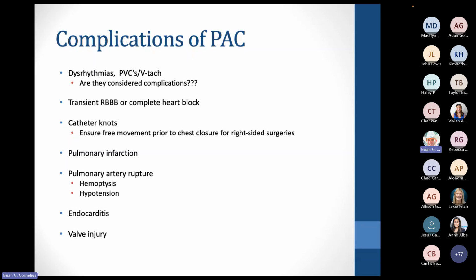So that's one of the reasons so many places are very cautious about how they maintain the syringe on there, what they do with the lock, those sorts of things, so your catheter doesn't inadvertently wedge. If that catheter does wedge or you do wind up with pulmonary infarction for any other reason, it's somewhat common to have rupture of the pulmonary artery. That tissue is under a lot of pressure, so if it becomes ischemic, it's probably not going to do real well. It's not going to perfuse as well. So just be mindful of that happening.